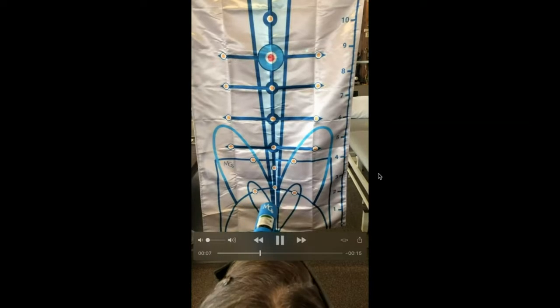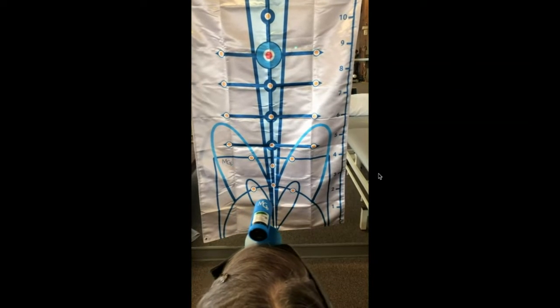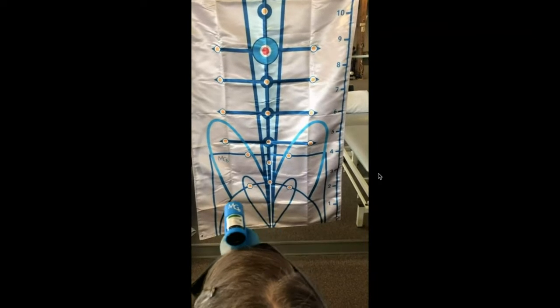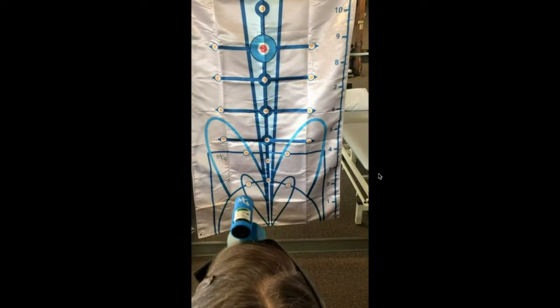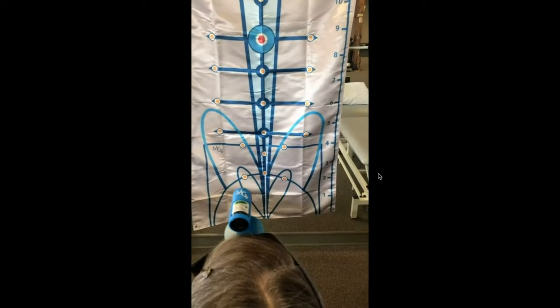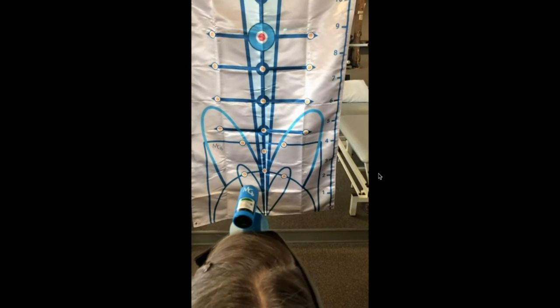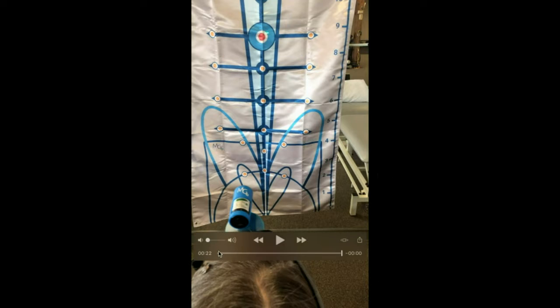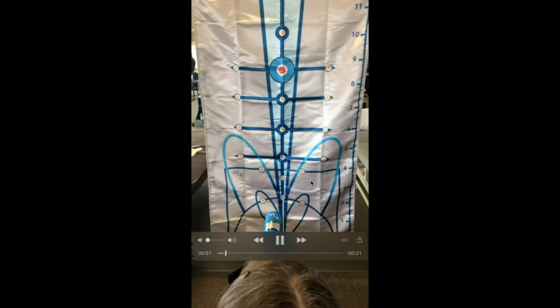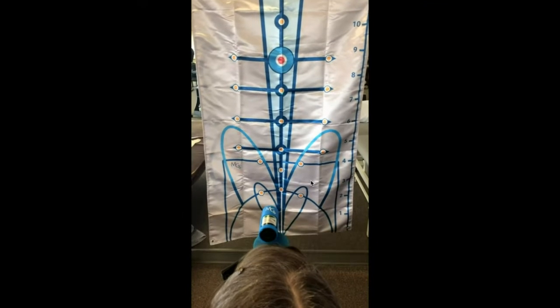I need to remind her, hey, don't look directly at the laser. You're going to be looking at a bottom line, but let's try to go back and forth at a faster cadence now and see if we can get closer to 1 hertz, which is our standardization for doing the VOR, going side to side. And now, if we watch this again, she's really trying to increase her speed and keep equidistance.